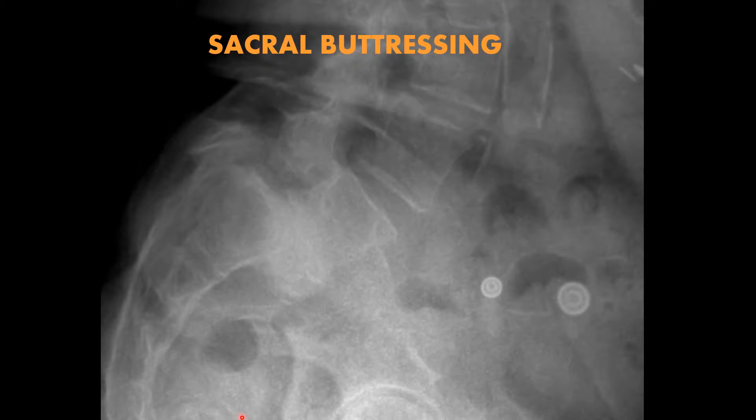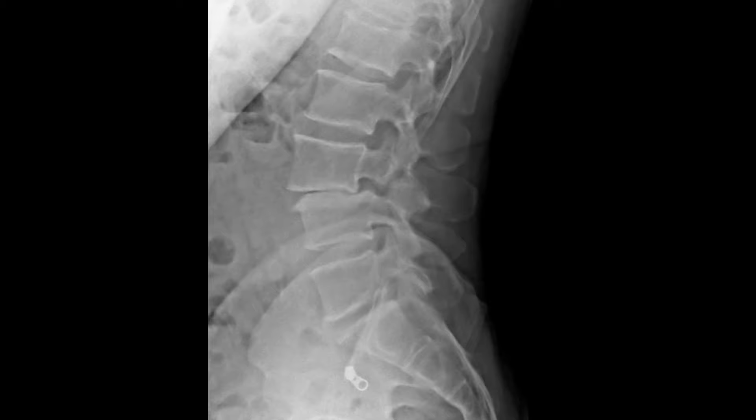Another example of a pars defect, this one at L3, with an anterolisthesis of L3, severe degeneration, subchondral sclerosis, and osteophytic ridging at the vertebral end plates. You could also argue there is a trapezoidal shape of that L3 vertebral body — another good example of these findings.